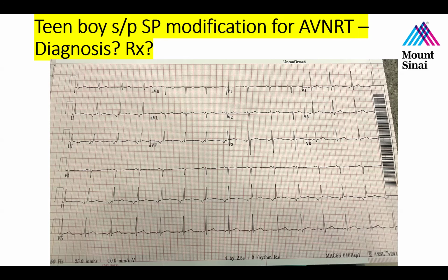And this was one of the first examples in my career where we had a patient who needed an epicardial ablation. So we actually took that patient to the cath lab. We went transseptal. It was coming from the roof of the left atrial appendage. Our signals were very early, preceding the P wave by up to 60 milliseconds. Every time we would ablate, it would go away and then it would come back.